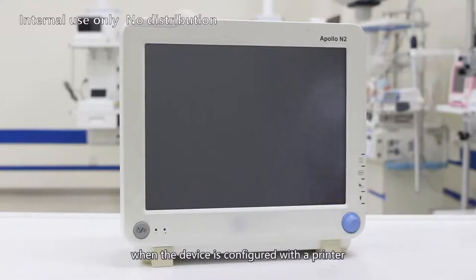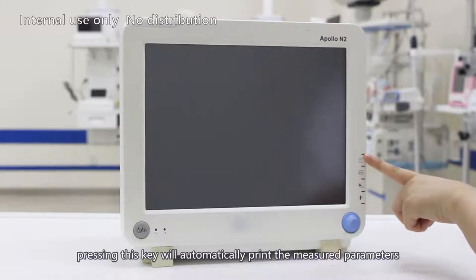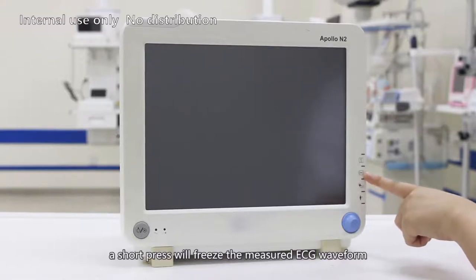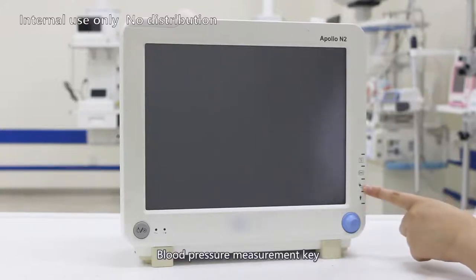Record key. When the device is configured with a printer, pressing this key will automatically print the measured parameters. Waveform freeze key. A short press will freeze the measured ECG waveform, which is convenient for doctors to carefully check abnormal ECG waveform.